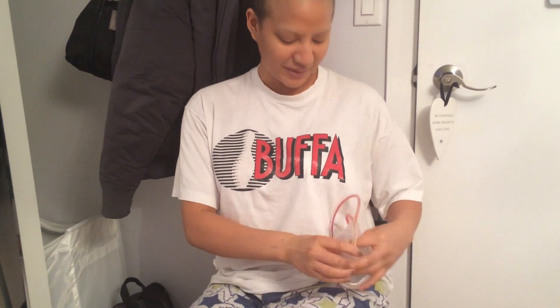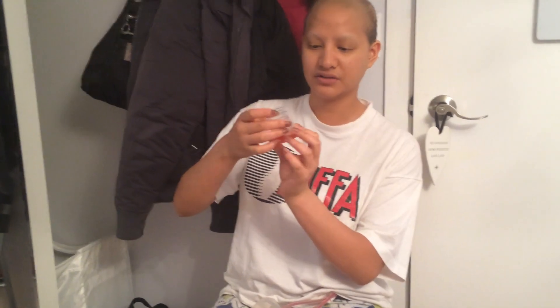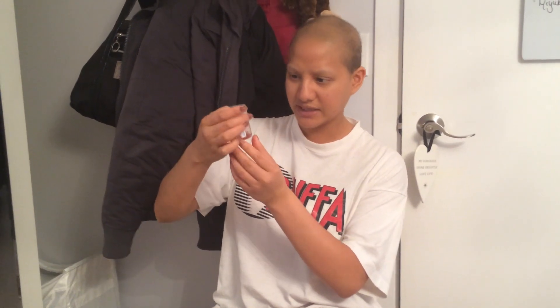Close the valve. And then I would pin it back to your shirt — otherwise it just hangs out of your body. This I have to deal with for about seven to ten days so all the little excess liquid is drained out. It's pretty annoying. Then you measure how much is drained out — this is 15 milliliters, and this is half of 15 milliliters. Then I have to record it and show that log to Dr. Denisopoulos, just so that he has an idea of how much liquid is coming out of my wound.